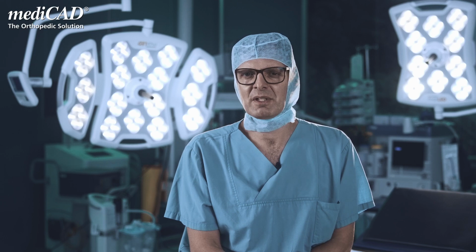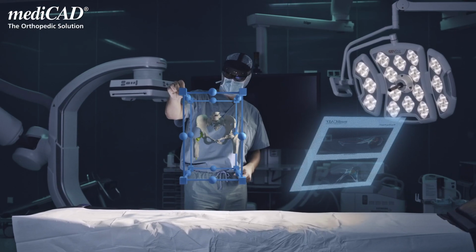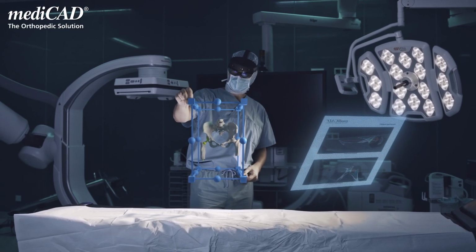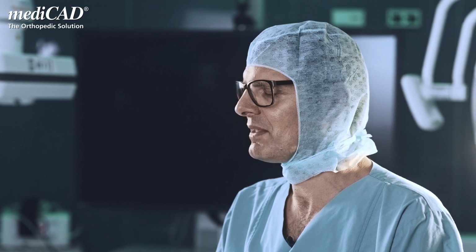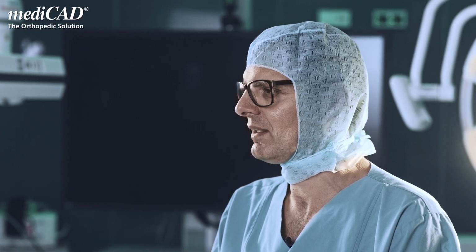In addition, I can of course project information from the normal HIS system onto the HoloLens if I want to have a further look at current laboratory data, or if I want to have a look at the patient's medical history during the surgery.